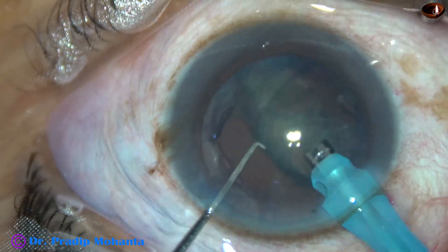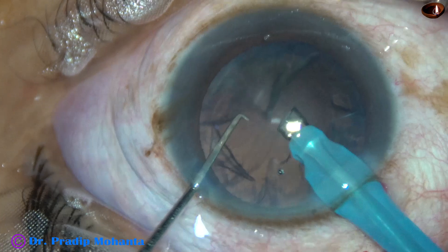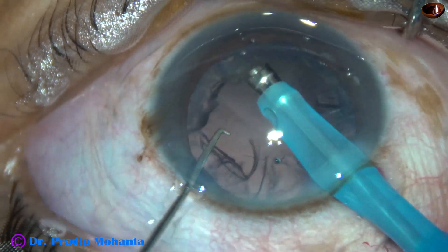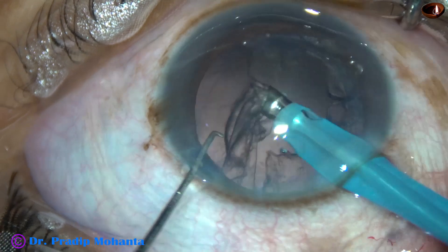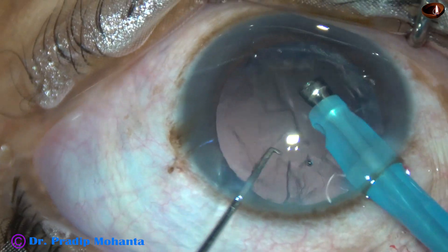Just eat it off from above downwards. In no time the nucleus as well as the epinucleus is done. Now I go to irrigation-aspiration mode and remove a portion of the cortex by the phaco handpiece itself.